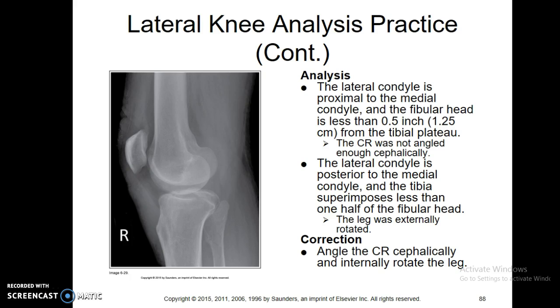This one, the knee needs to be bent a little bit. Adductor, heavy part of it. Looks like it's right there. That looks thick too, so it's a little harder to see. It's hard because they get the angle wrong and they get it a little bit rotated. So make sure you check that and get the proper bend in the knee as well.